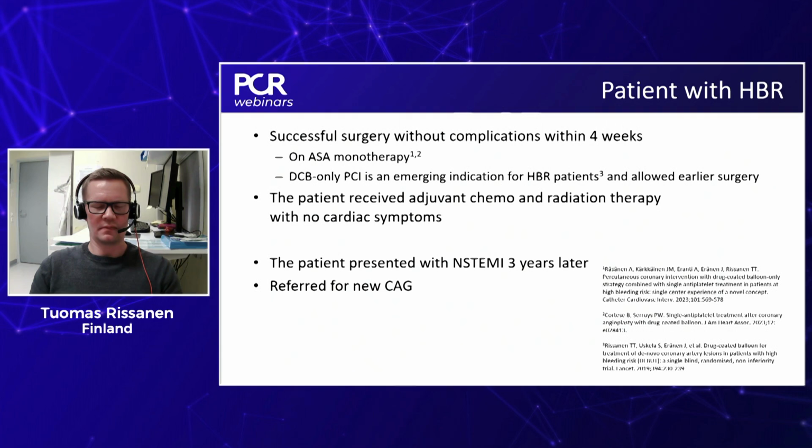Okay. But it's possible. I'm really sorry to have to cut the discussion, but I know that you're keen to have used this case because she comes back for a further angiogram, so perhaps you can share with us the clinical context and then those subsequent images, and we'll have to finish after showing those results. Yeah. So the patient was fine for 3 years, but again she presented to us with NSTEMI at this time and was referred for angiogram.